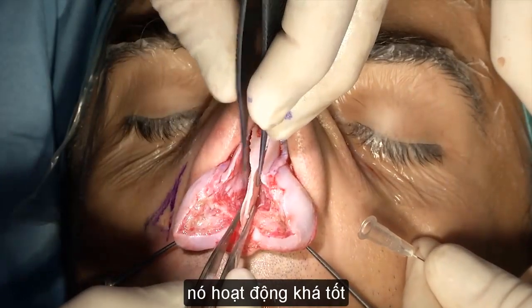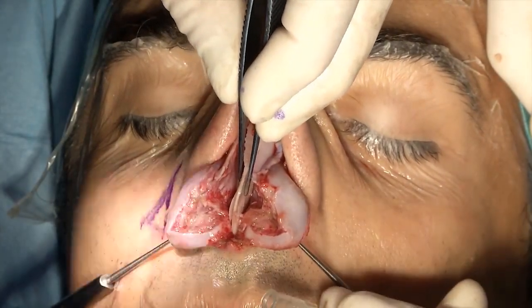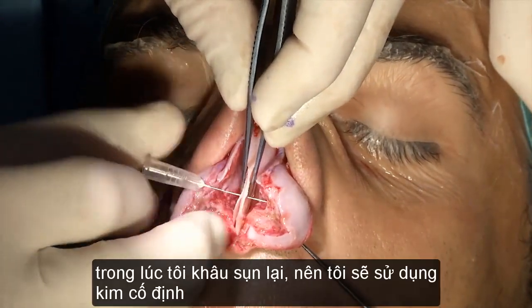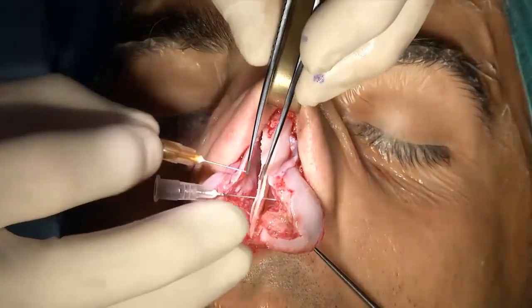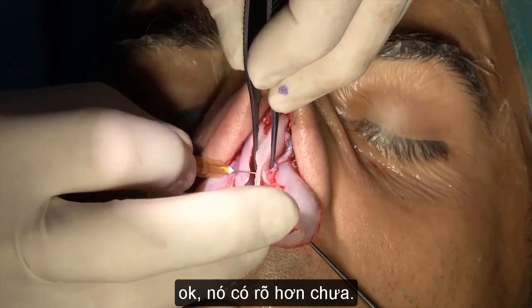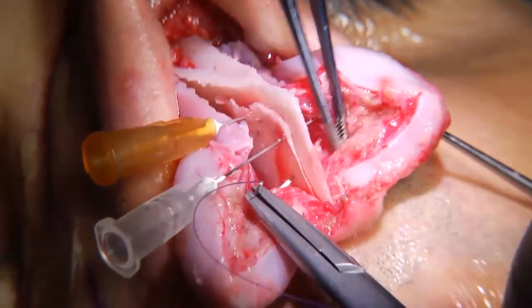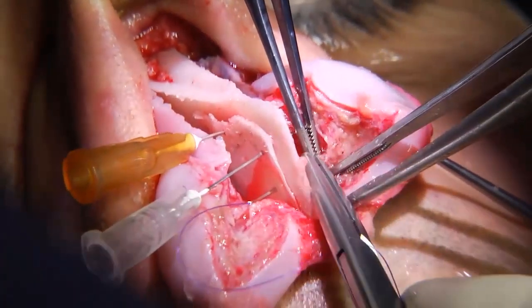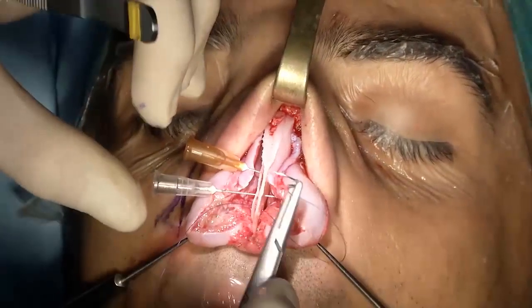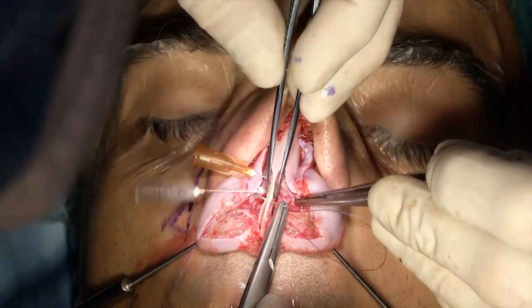This works pretty well. Now I don't want this thing to cause me problems when I have to suture the cartilages. So this is the wrong needle, but it doesn't matter. All right, is that clear? Help me though. Yes. A small needle instead. Do you want to leave that one?